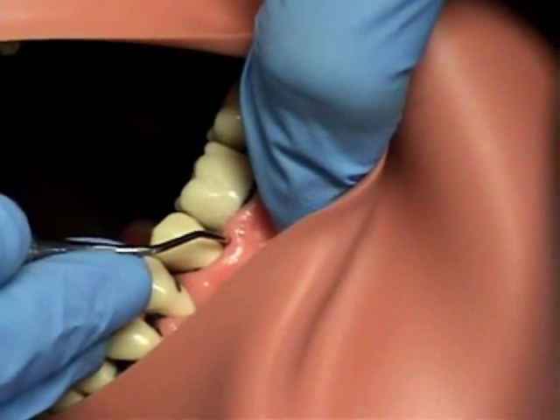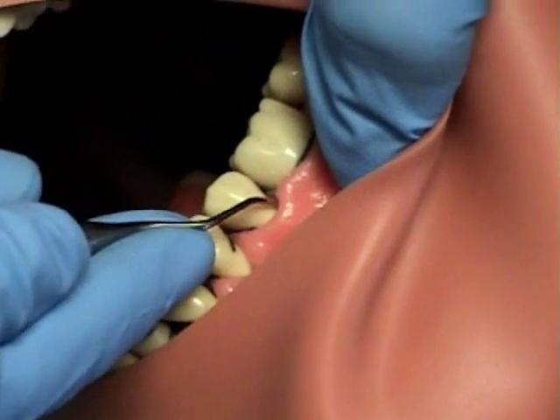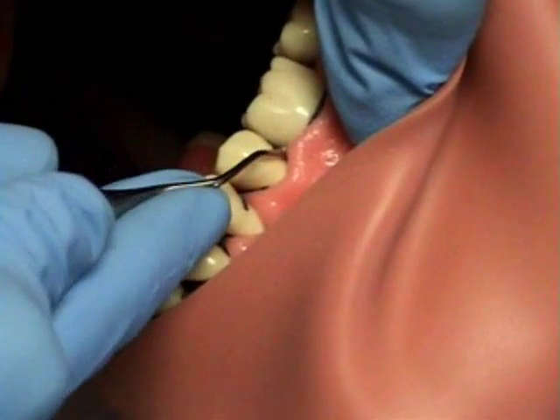Although many say that these instruments are very nice because you don't have to change instruments when doing the mesial and distal, there are some negative points to the instrument, or disadvantages.